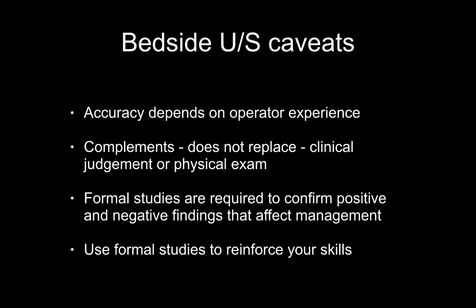Before we begin, I just want to touch on a few caveats to keep in mind when using bedside ultrasound. First, as with any ultrasound study, the accuracy will depend on the experience of the operator who's obtaining and interpreting the images. So I think we should be humble as we're all beginners learning this new technology, and we should be wary of overconfidence when reporting our findings.